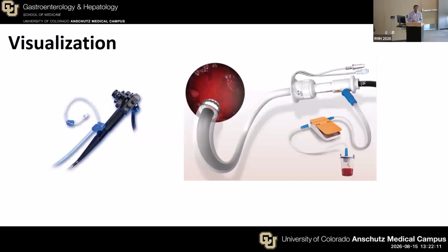The next is what is in our toolbox for visualization. You're trying to remove blood, snare, spend 2 hours in an endoscopy. So knowing and recognizing what are the tools that are available. So this is a BioVac system here on your left. And this helps look at and clear out blood clots. It bypasses the natural suction of the scope and allows you to connect this. You can really suction big clots.